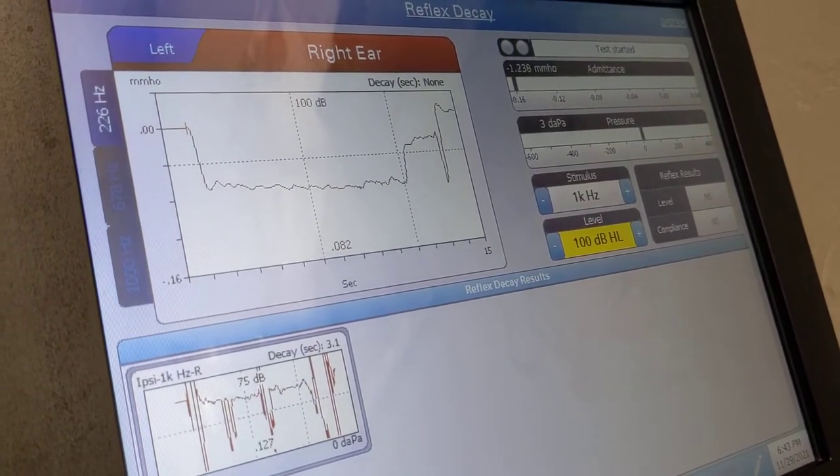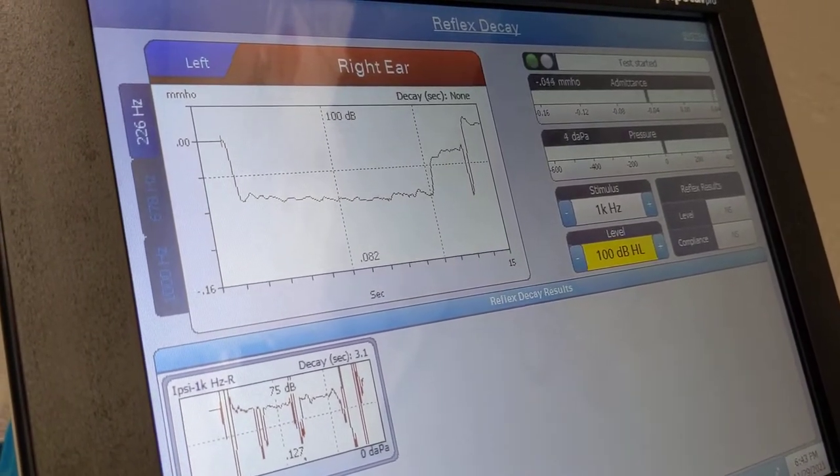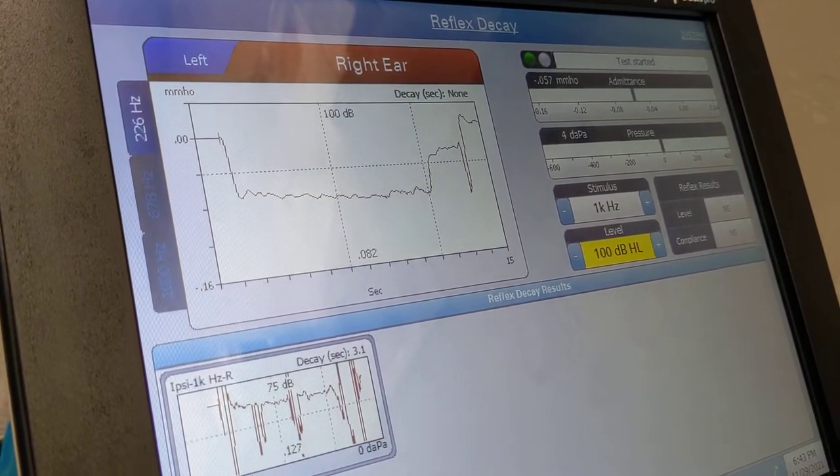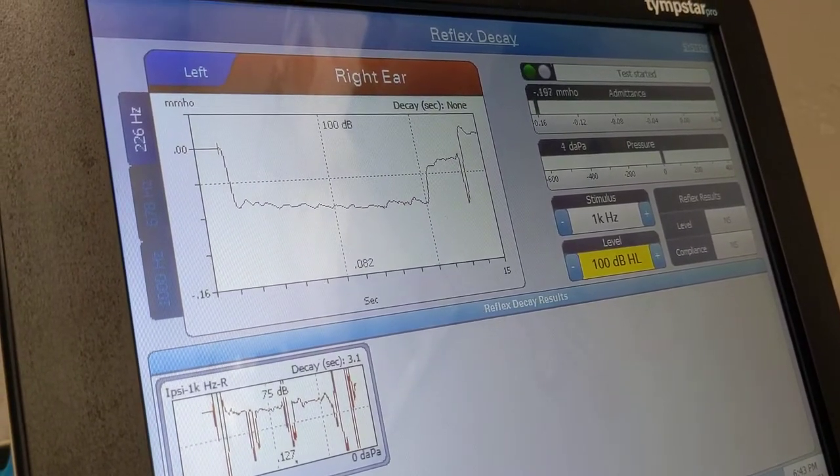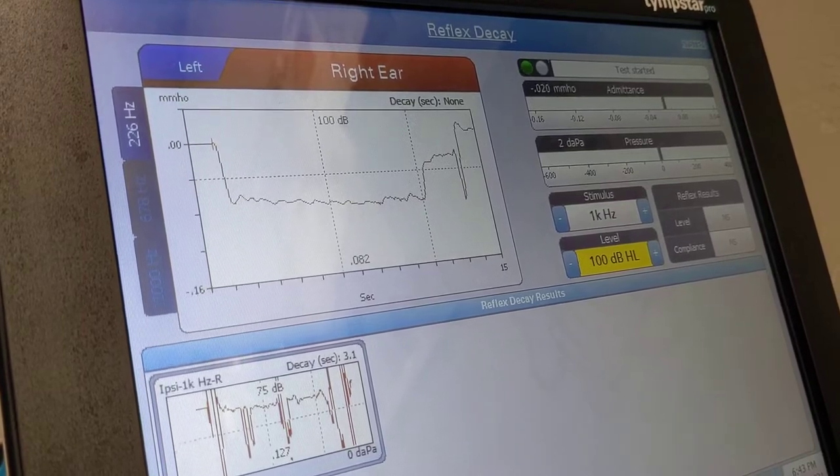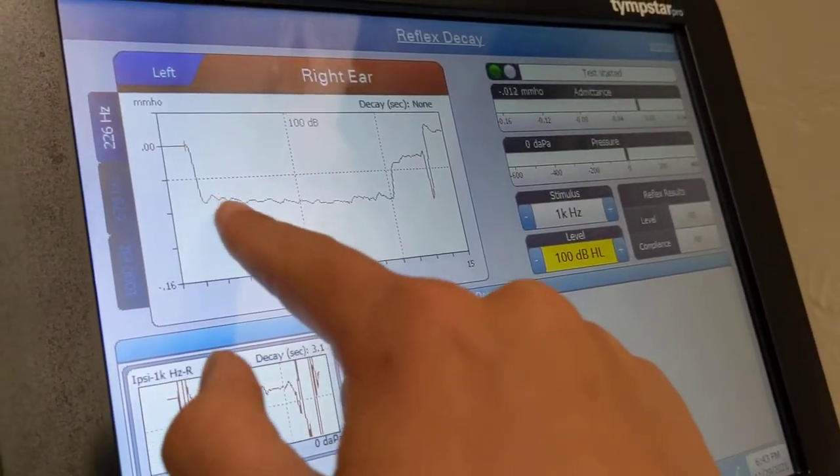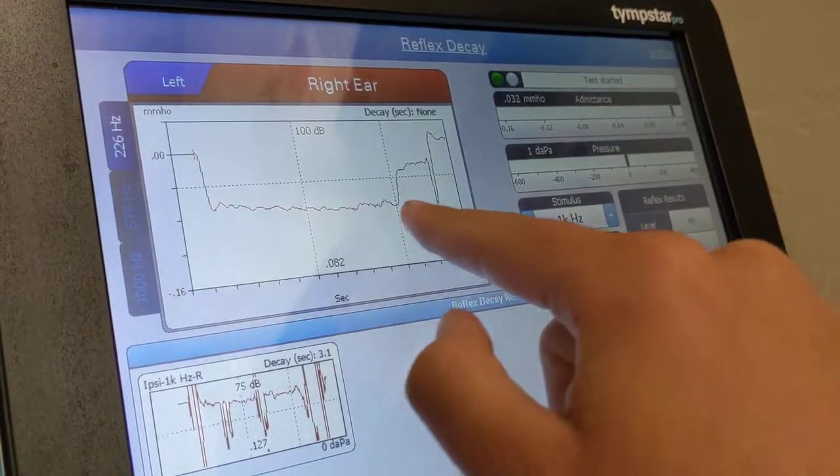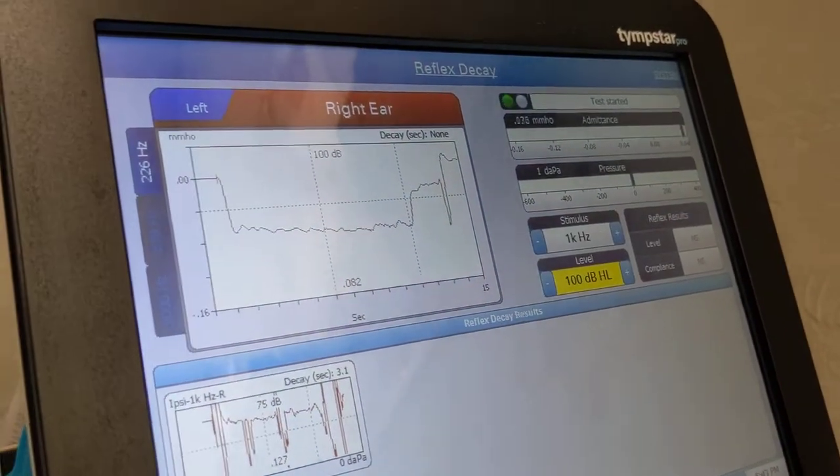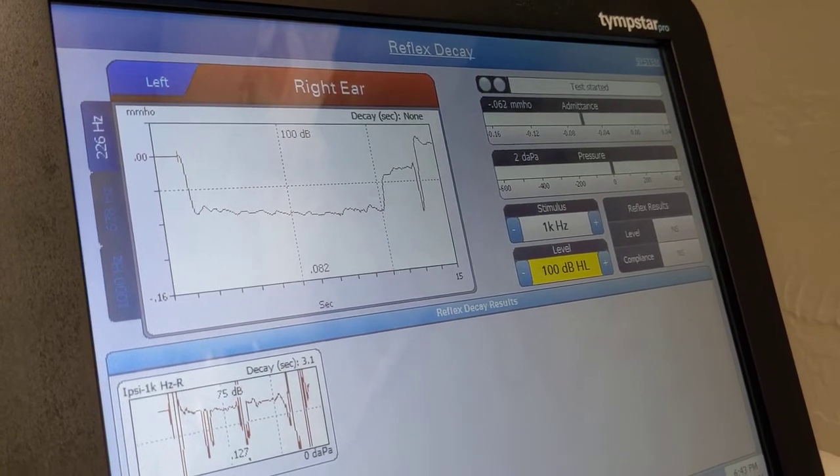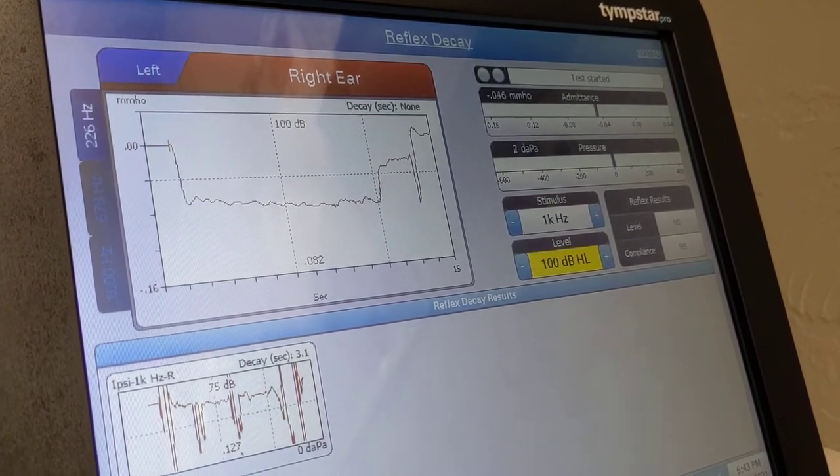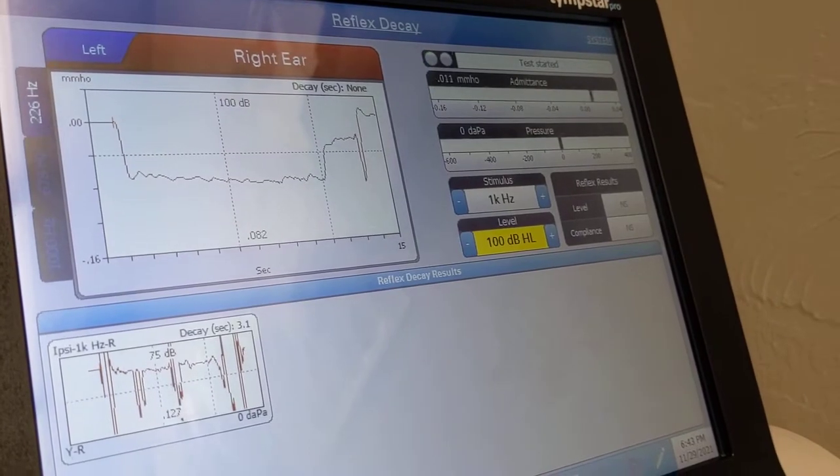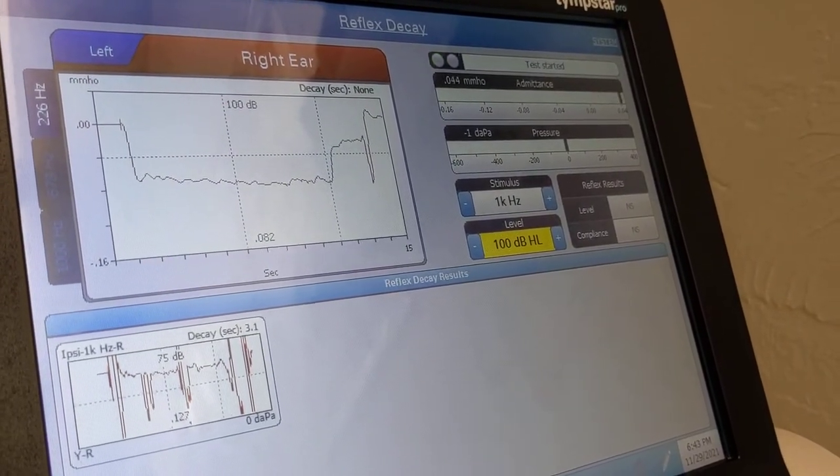so this is what we just tested at 1000 hertz at 100 dB hearing level. We can see that this decay shows that I was able or my stapedius muscle was able to maintain a contraction for roughly 10 seconds looks like, which is great. And yeah.